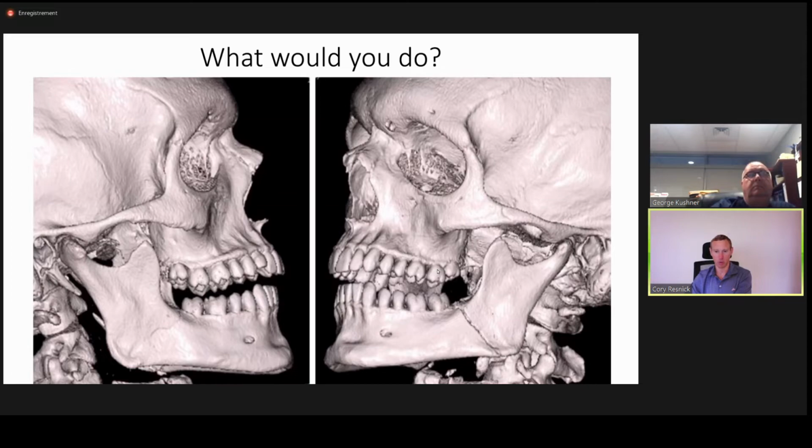But I think in a good occlusal relationship scenario where there are not a lot of fractures in the dentate segment, and I'm planning to use them only for intraoperative fixation, then three screws is often sufficient in my hands. And then, yes, I agree, Dr. Kushner, the palatal fracture question is a little bit beyond today's discussion, although I will just say that when there is a palatal fracture, it's going to be much more important, and this doesn't apply only to palatal fractures, but other complex fracture techniques.